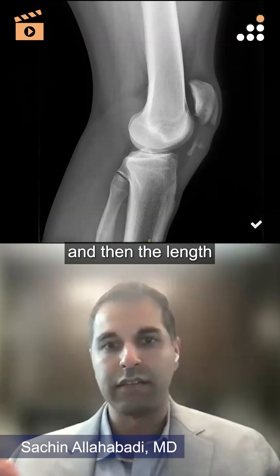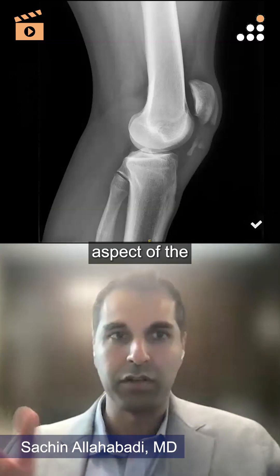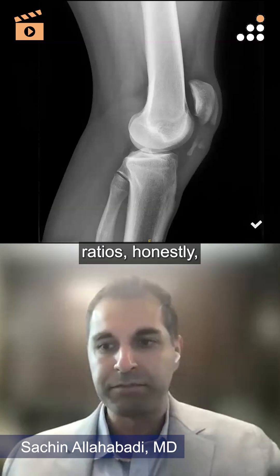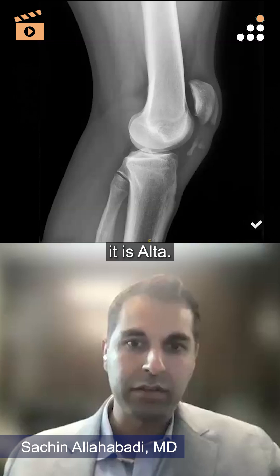The Caton-Deschamps ratio takes the length of the patella articular surface and then the length from the inferior aspect of the articular surface of the patella to the tibial articular surface. But more than the ratios, honestly, in this setting it's pretty clear — it's alta and the patella is sitting high.